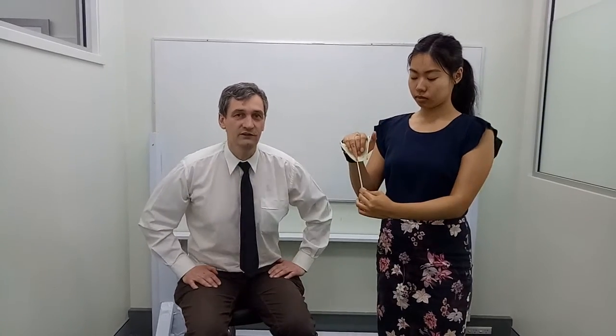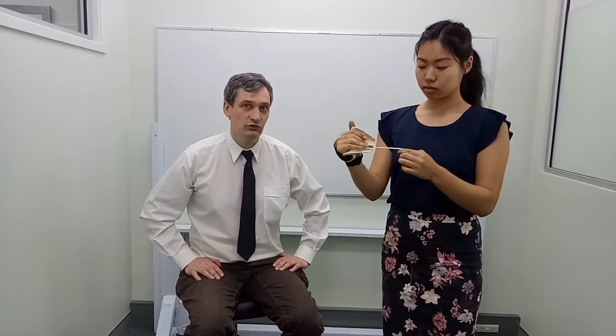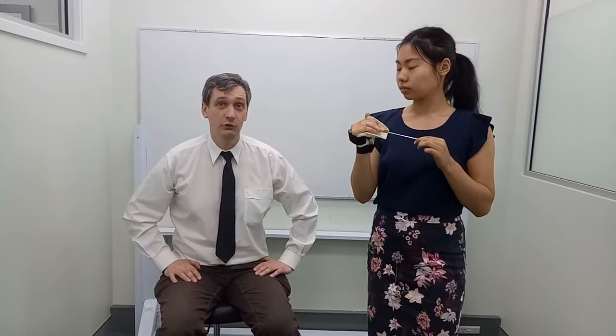So here we have a splint where the fracture is in the distal part of a proximal phalanx, and we're creating a torsionally realigning force as well as reducing that volar apex fracture by having as much flexion as we can. So those are the two types of splint positions that we recommend.